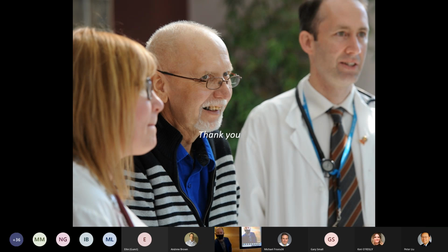Yeah, that's an excellent question. We did not. We could though. The reason we chose to do abdominal imaging is that there's quite a lot of work now showing that what you find on axial imaging is a good representation of what's going on in the whole body.